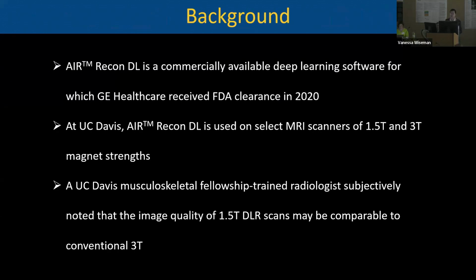AIR Recon DL is a deep learning software for MRI, and it's intended to improve signal to noise ratio, reduce noise and artifacts, and shorten scan times. We use this at our institution on a couple of our MRI scanners. The motivation for this study was that one of our MSK attendings, Dylan Chen, noted in his day-to-day work that the quality of the MRI exams on the 1.5T scanner with deep learning reconstruction, which I'll refer to as DLR, was so good and so impressive that it could be comparable to the standard 3T scans.